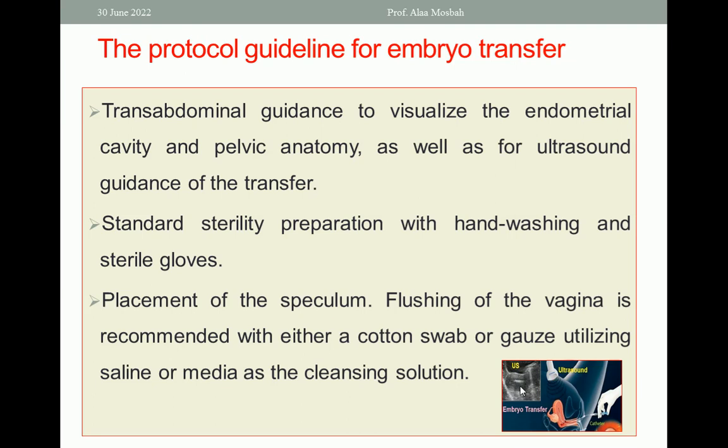Okay, what about sterility conditions? Standard sterility preparation with hand washing and use of sterile gloves. That's it. Okay, placement of the speculum, flushing of the vagina using cotton or gauze, utilizing saline. Either you use saline or use the media as a cleansing solution. Okay, please don't use antiseptic or broad-spectrum antiseptic or something like that. Please don't use it. Use either the media or saline as a cleansing solution.